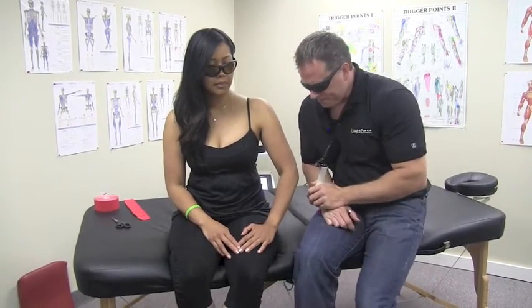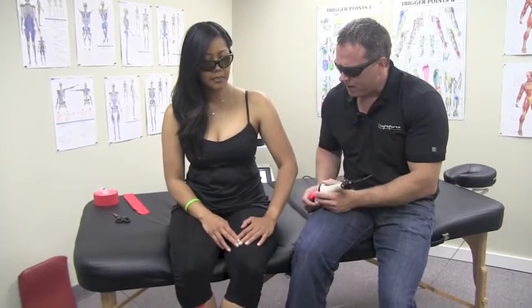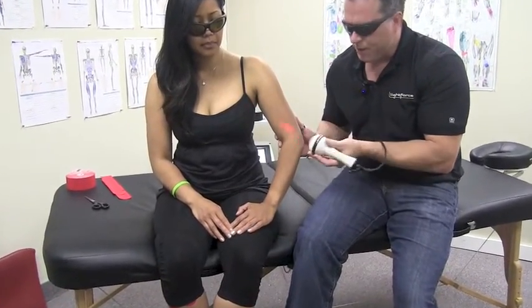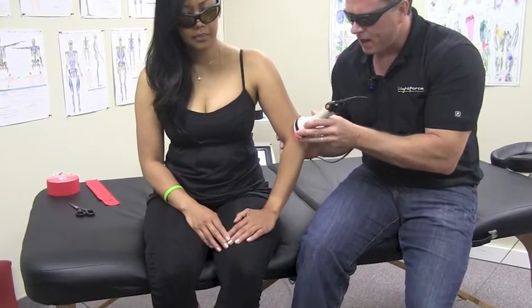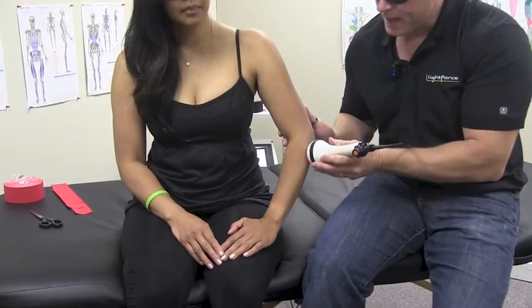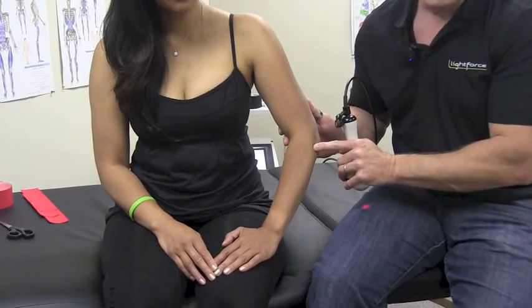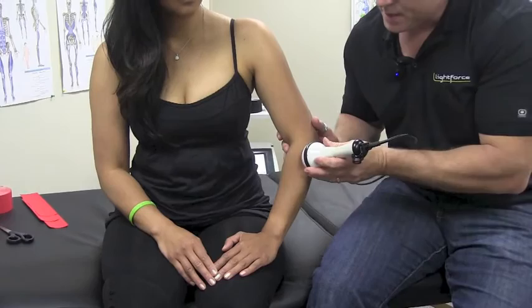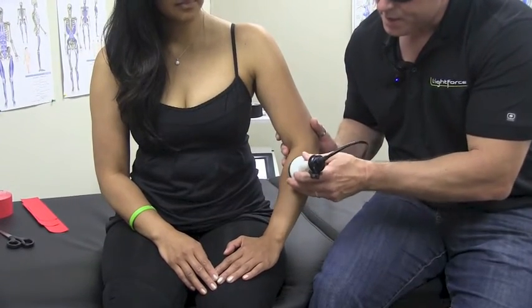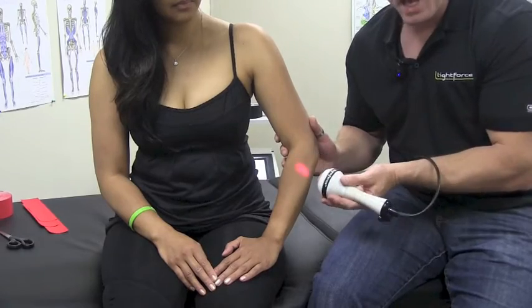With the laser I use the massage ball head. If I'm dealing with lateral epicondylitis, I'm going to go very lightly right over the lateral epicondyle where the swelling or inflammation is and most of the pain, because they've got inflammation to the tendon. Then I'm going to go down into the muscles of the forearm — the extensors — and this is one where I can add a lot more pressure.